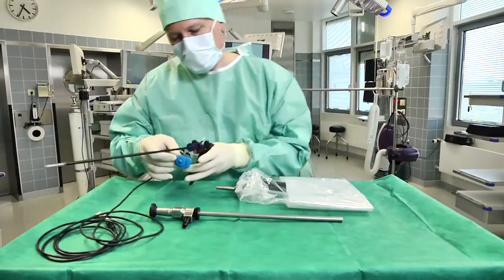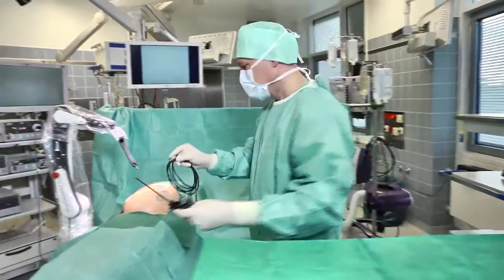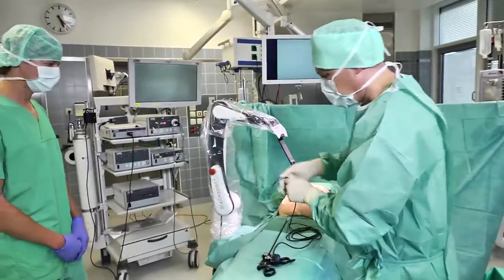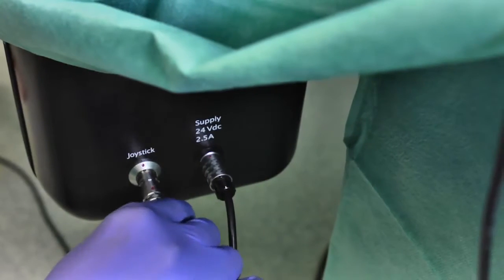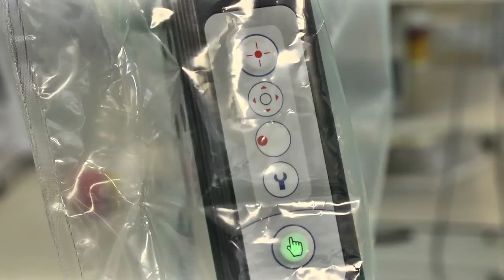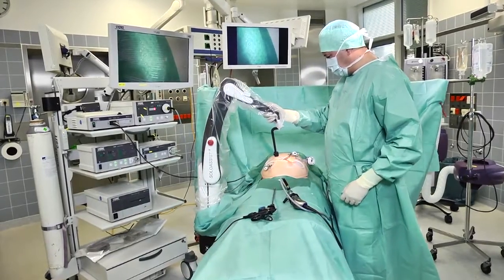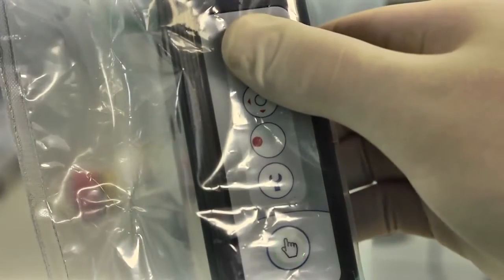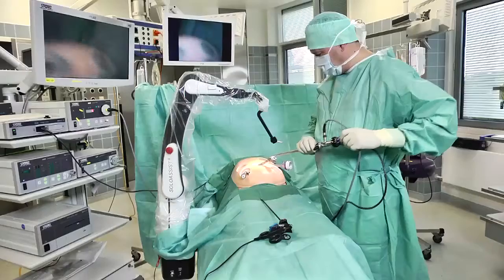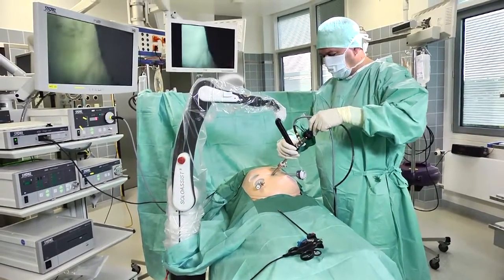The joystick is inserted in the forceps and fixed there. The surgical staff hand over the connector for the joystick so that it can be inserted directly into the socket on the device. As soon as the ready LED on the arm lights up, the Solo Assist is ready to operate. Prior to surgery, the surgeon introduces the tip of the universal joint to the trocar point, saving this position by pushing the TP button. The endoscope can then be connected to the arm and the surgeon can commence the surgical intervention.